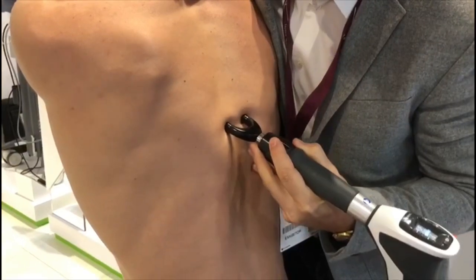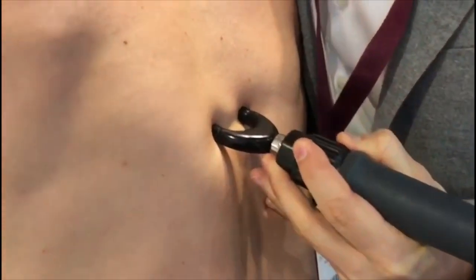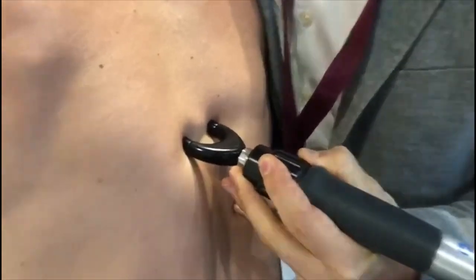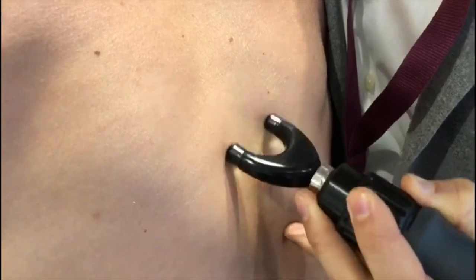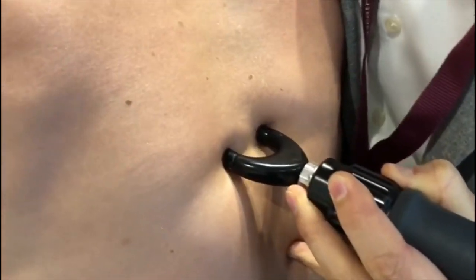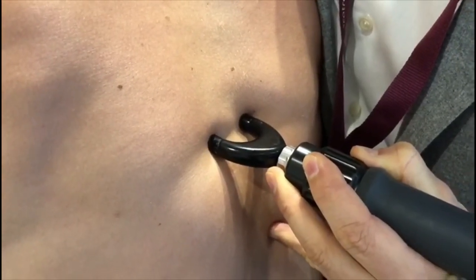So I will palpate with this just to find the joint, and I will just stay there. This feels okay. Yeah. Yeah, good. All right, some hits like that. Then we'll see. There's another joint, and I will try to maximize the movement in this region.